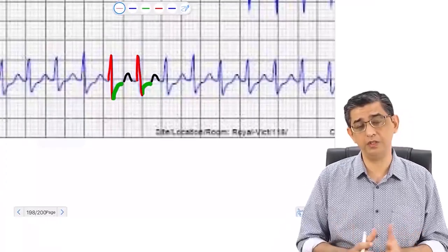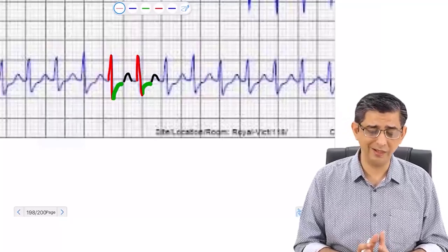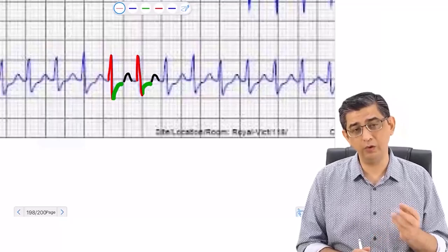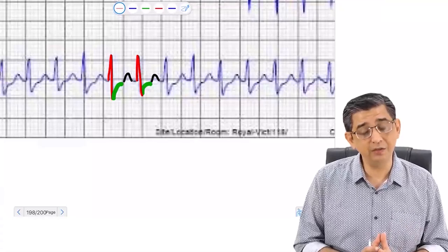You see, the QRS duration traditionally should be about 80 to 100 milliseconds. Here you can see that it's literally about 1.5, or I will put it rather at 1 small square. That would be only 40 milliseconds. So that is definitely lesser than normal.